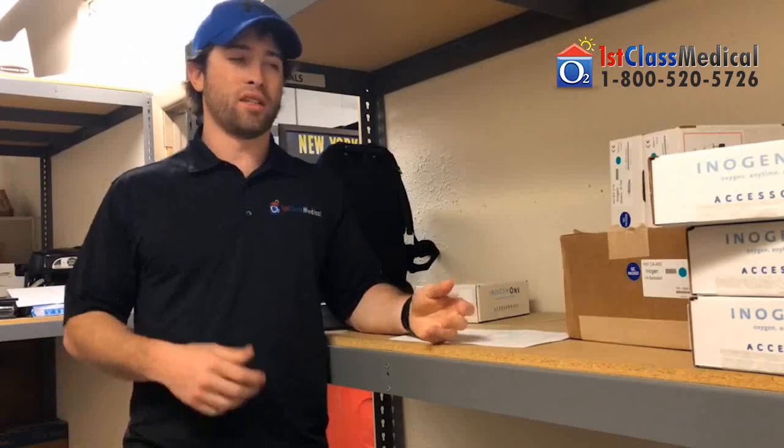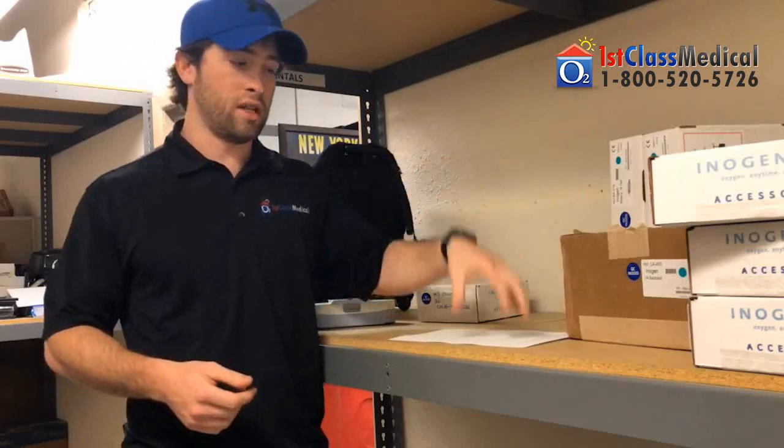Obviously, a lot of customers don't understand that, yes, we're an oxygen company, but we are not your typical DME company. We don't go through your insurance. We don't do all that kind of stuff. It's patient pay. We do put reimbursement codes on our invoice, so if the insurance does cover it, they'll reimburse you directly. But that being said, we're not open 24/7, and when it comes to portable concentrators, they're actually supposed to be supplemental oxygen. So you should have a stationary concentrator. I never recommend purchasing a portable and getting rid of everything. Even though you could, I don't recommend you do, because if the portable goes down, you need that oxygen.